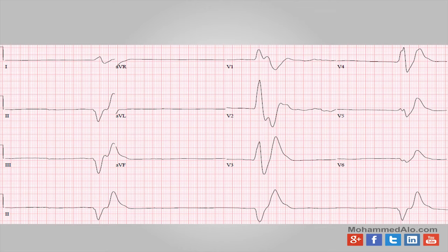So what is this? This is your basic hyperkalemia. Now, this is the extreme form of hyperkalemia. This is over 7.5, and it's probably over 10. This is the EKG where you look at the people around you and you say, why the hell are you doing an EKG? Why aren't we doing chest compressions or something on this guy? But I'm glad they did it because I got the EKG and I'm able to produce it here for you guys. This is almost that sine wave pattern that everybody talks about. But this is a very dangerous EKG. You should be putting in the dialysis catheter, giving him loads and loads of insulin right away.